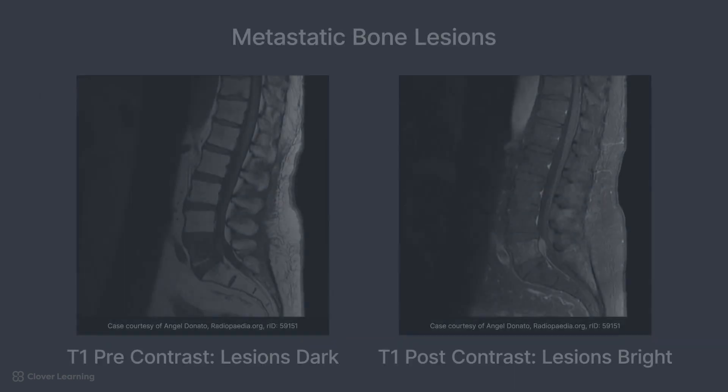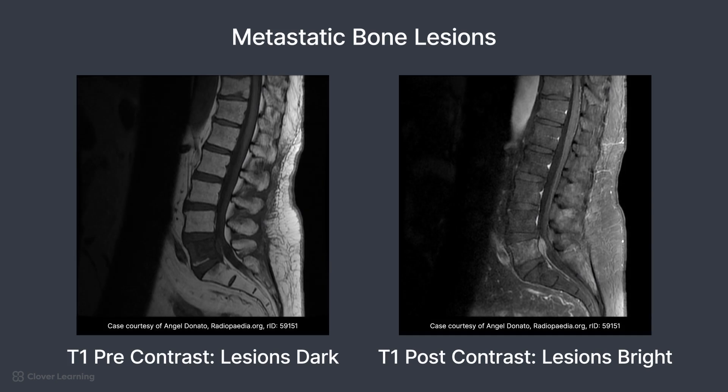Additionally, for patients with cancer, metastatic bone lesions may occur from a primary cancer that has spread to the spine. The metastatic lesions appear as darkened areas within the vertebral bodies. Contrast media would be needed for this pathology, and the metastatic lesions would appear bright post-contrast.